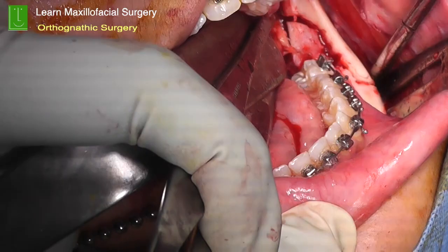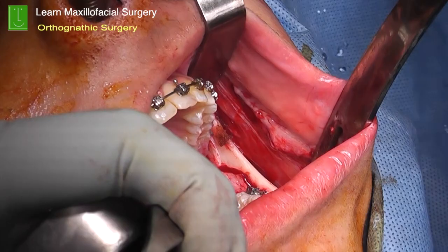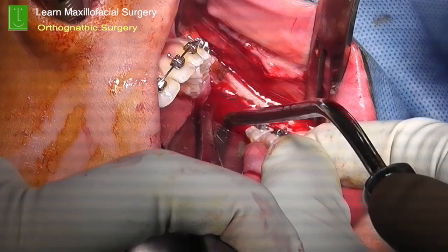That's where you're seeing the cuts being made, the lingual cut there, the vertical cut, and the buccal cut, which has been completed. Once the cuts have been done, and it's also important that you make sure that the lower border has been completely cut, then the split is very easy.